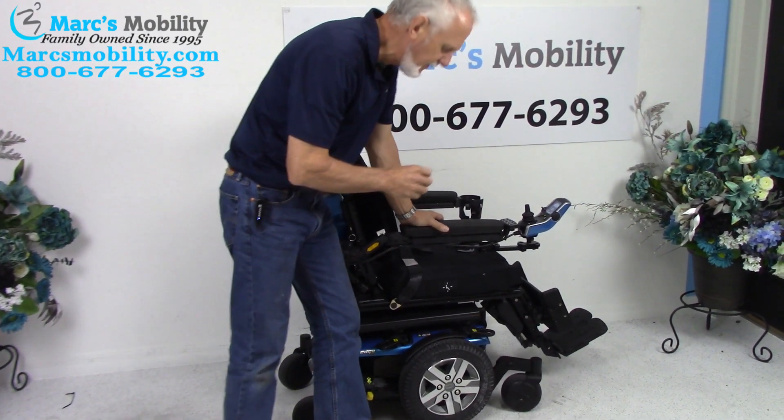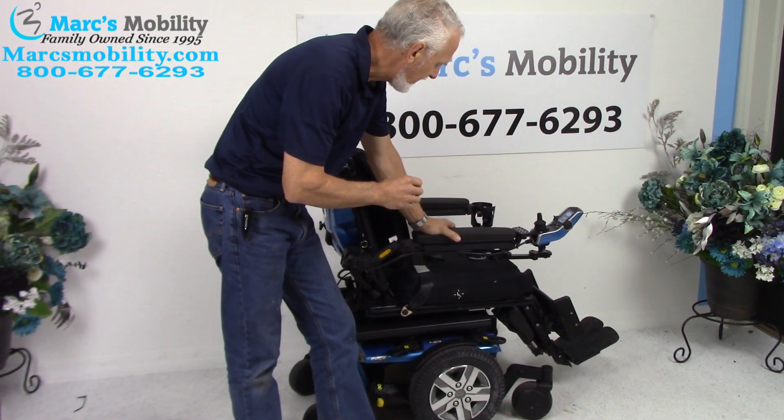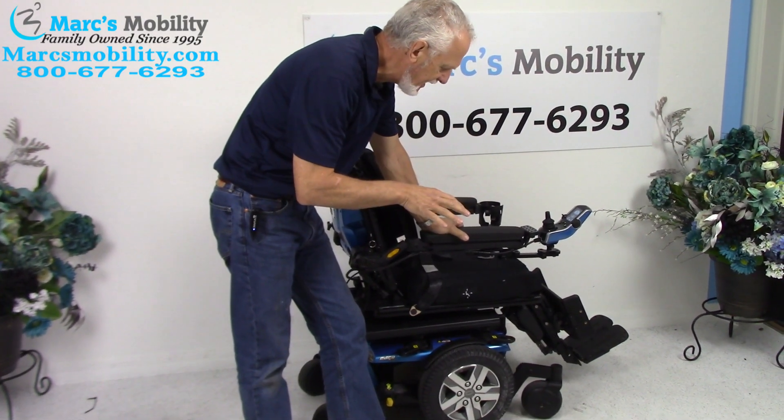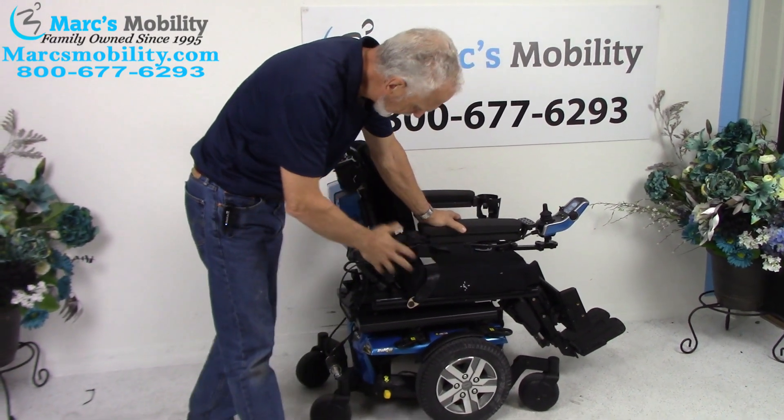We have here a Quantum Edge 2.0 power chair. This power chair has electric tilt, electric recline, and electric legs. It has two miles on it, so it's practically brand new — beautiful color.